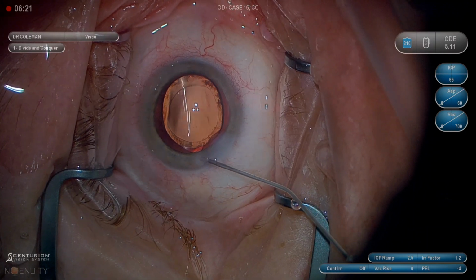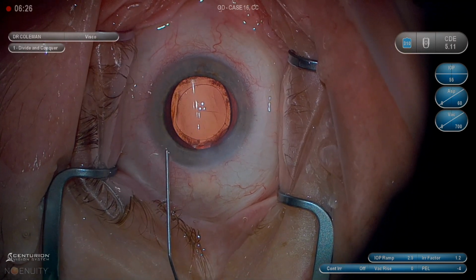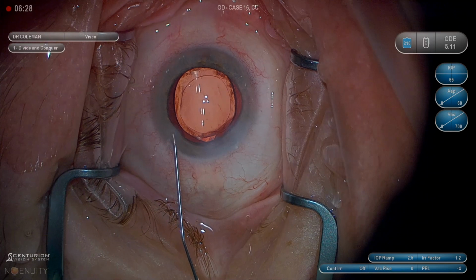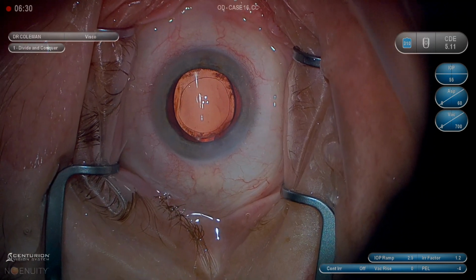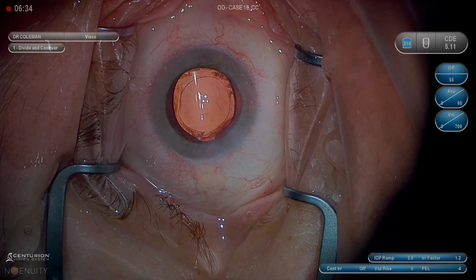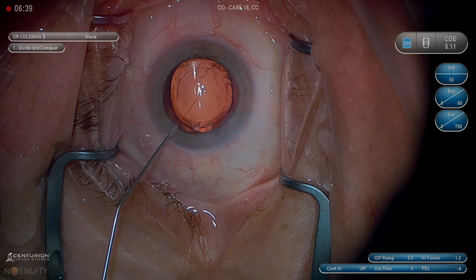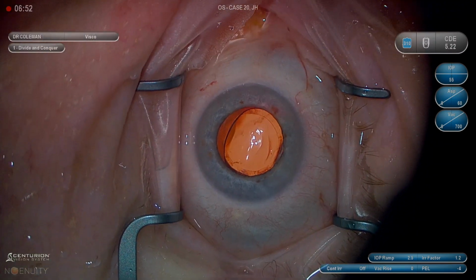So I'm going to talk through these last cases as they go. So we're 50% of the way between the inner and outer portion of the wounds, almost perpendicular, hydrating half of the paracentesis. And in general, I'm trying to overpressurize the eye slightly. I want the pressure slightly higher than I'm ultimately going to want it to end up, and I'm going to set the pressure when I place antibiotic.